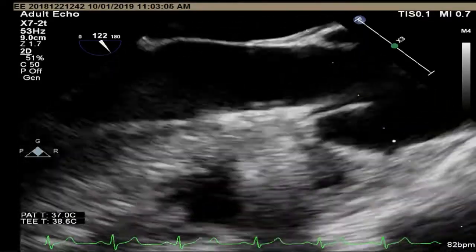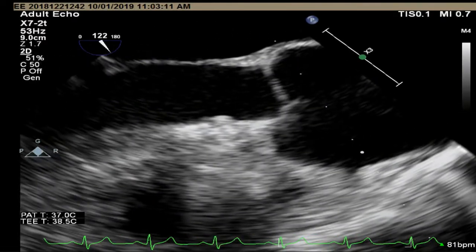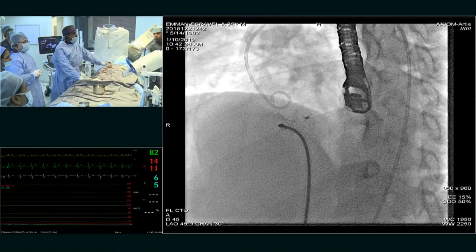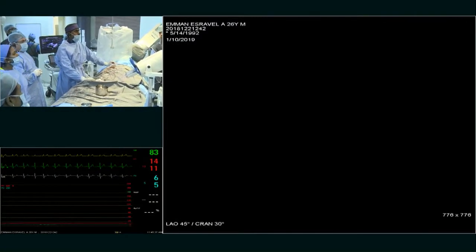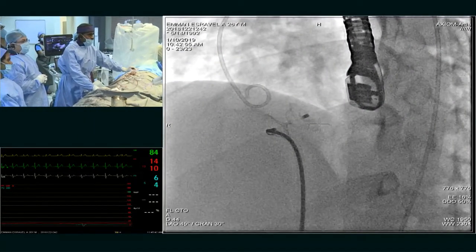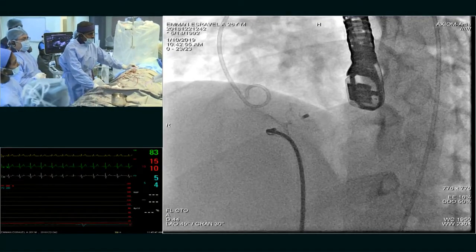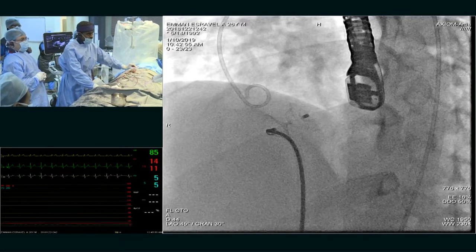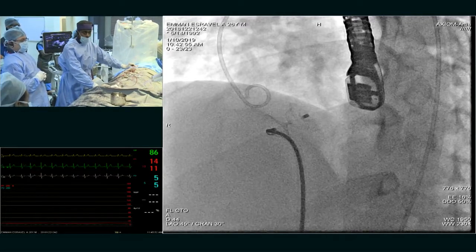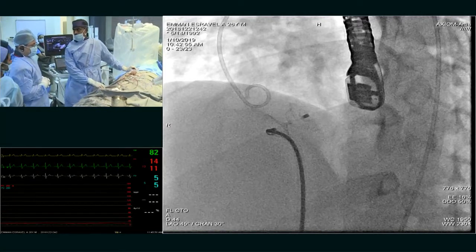Okay, table up. Mag on the aortic valve. Aortic valve, double, zoom it. Ready for 25 at 15. 1200 psi. Yeah. So we are setting up first an aortic root angiogram, and then I will set up a left ventricular angiogram.